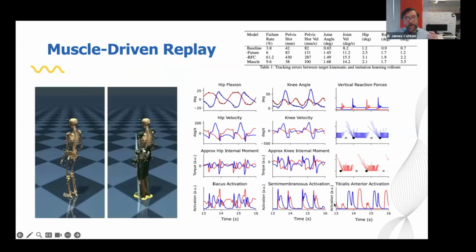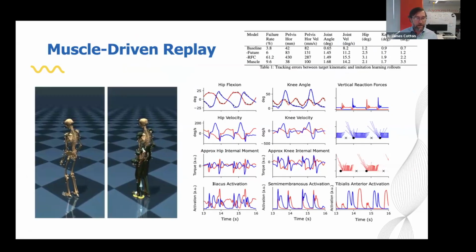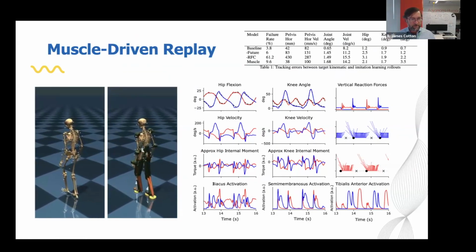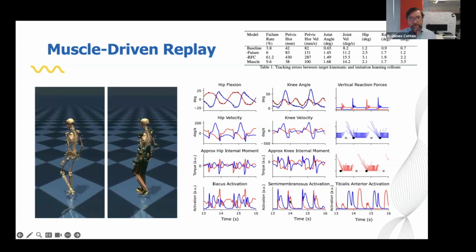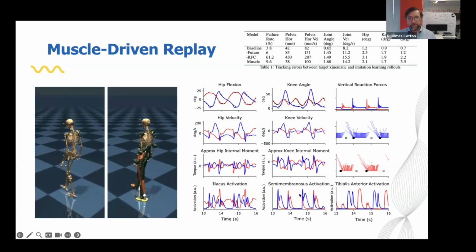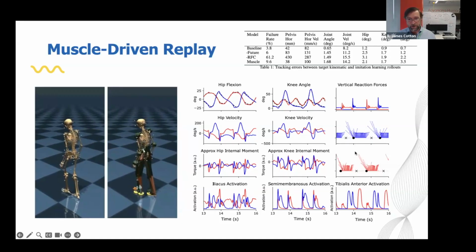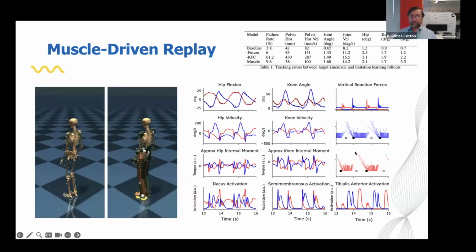although I'm not going to pretend there's not a lot of work to validate it. And going even more into things that need validation, we can even do this with a musculoskeletal model that is learning how to then replicate the movements it's seeing based on muscle activation. So this is slowed down basically because the simulator runs a lot faster than the video frame rate. But critically here, you can see we pick up asymmetries in the muscle activation firings that definitely make sense based on this person's impairment. And we also see differences, asymmetries in the propulsive from their impaired side. So check that paper out if you're interested in it.